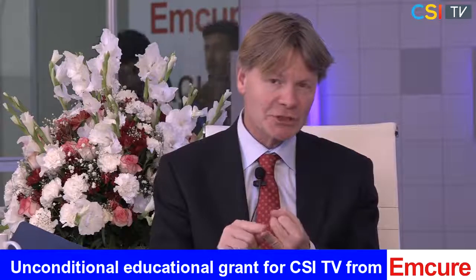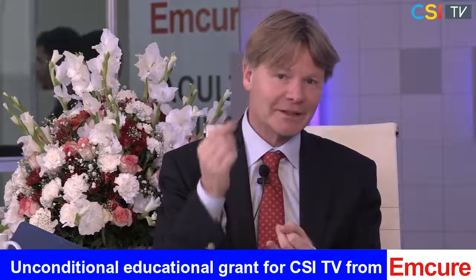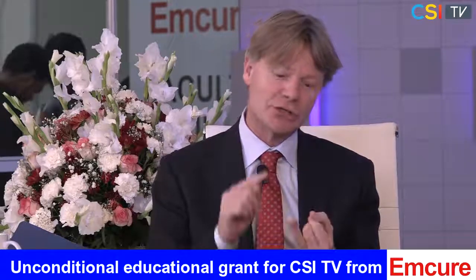Fibrosis formation with the T1 mapping, measuring extracellular volume, reflecting the amount of fibrosis you cannot visualize, but you can quantify it. And I believe that if we want a better time, for example, when we need to change the valve in aortic stenosis, when we need to repair or replace the valve in mitral regurgitation, we need to understand how much fibrosis there is in the ventricle. And that's where T1 mapping is going to play a big role.